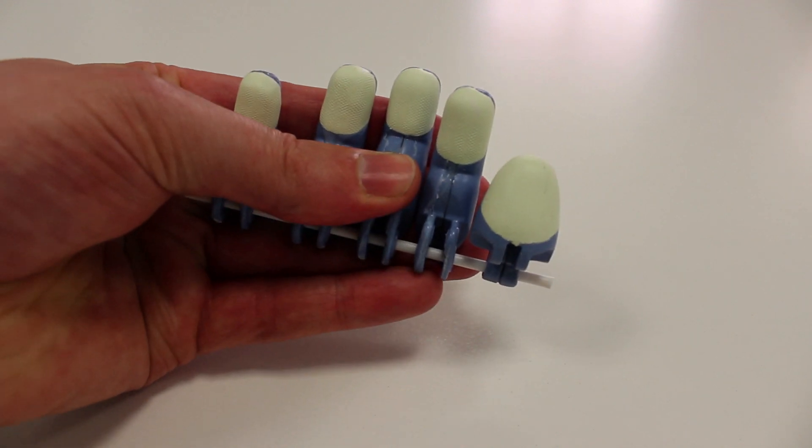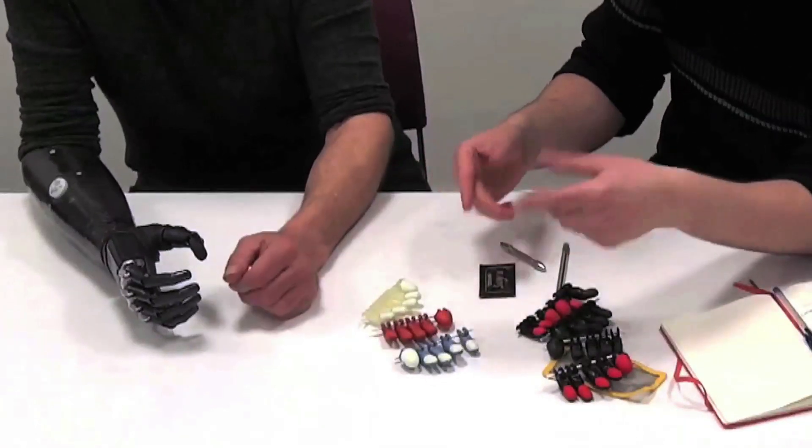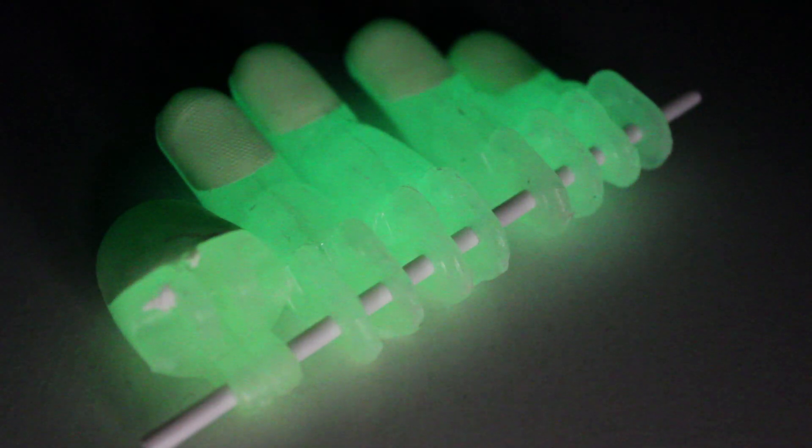This is mixing the two — the blue detects extreme cold, but it also glows in the dark. I designed this without knowing exactly what you want to get out of it, but it's like so many things in life: if you could select these and say you've bought 90% of your arm, you'd like the glow-in-the-dark fingertip variants so you can tie your shoelaces in the dark. It enhances your quality of life — if you can see what you're doing in the dark, you can just carry on with your life.